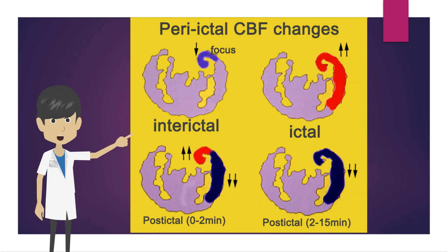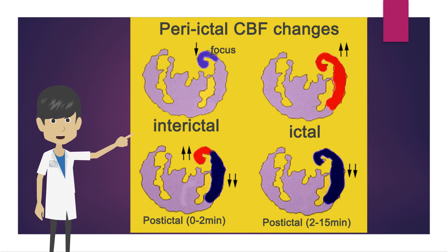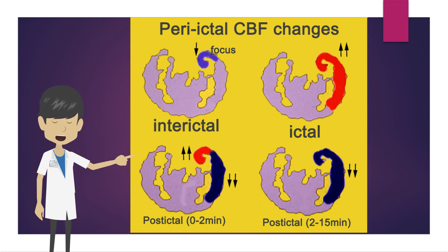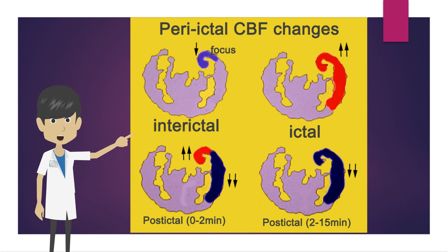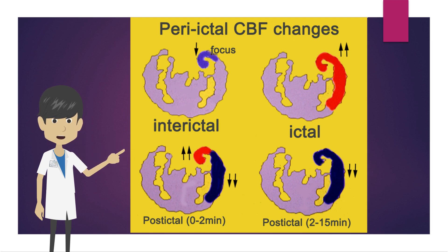Images of brain perfusion before and after seizures in temporal lobe epilepsy are shown. During the interictal phase, there is a decrease in brain perfusion around the epileptic focus. During seizure, blood flow increases in a wide area including the epileptic focus. After the seizure, brain perfusion decreases around the epileptic focus, and then decreases as seen in the focus as well.